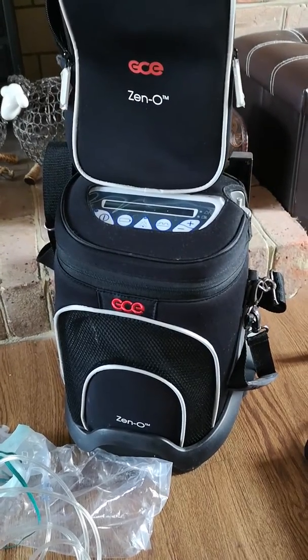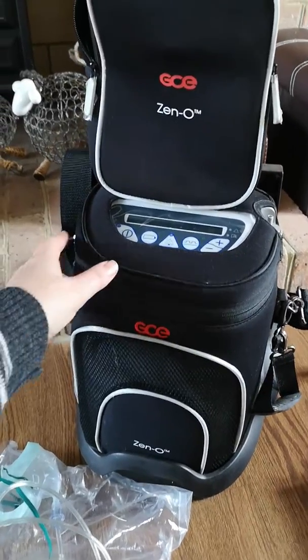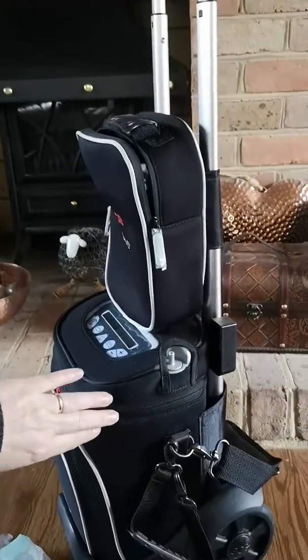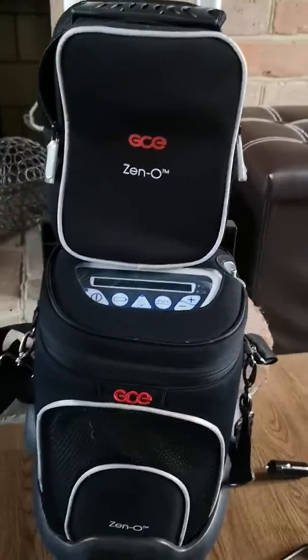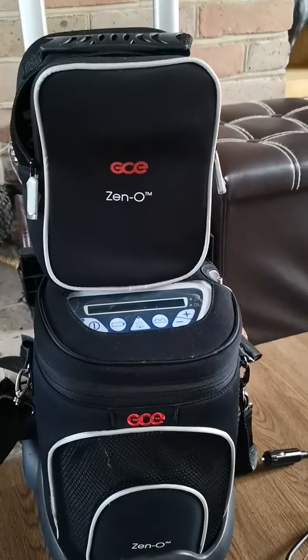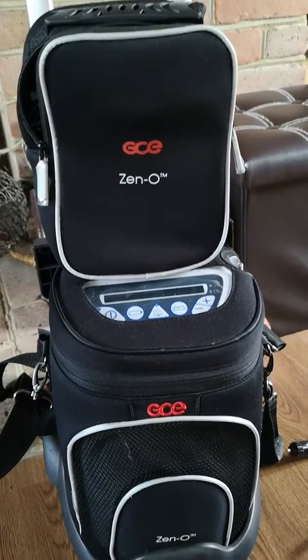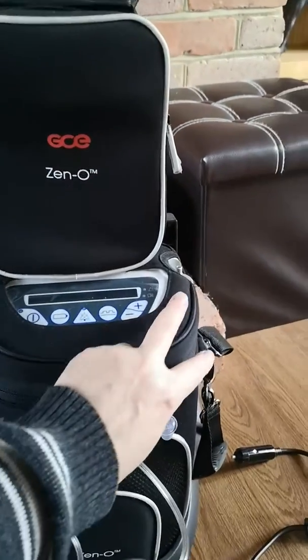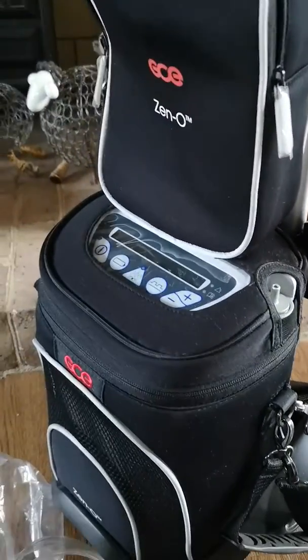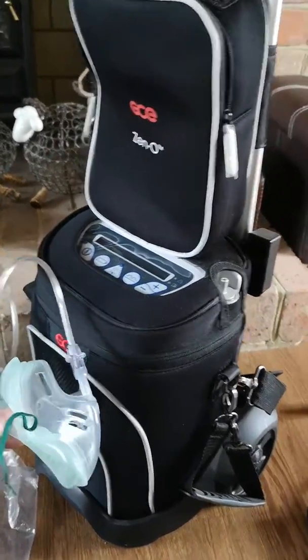Now I'm going to turn on the Zen-O Oxygen Concentrator to show you how loud it is. We don't use the Oxygen Concentrator all the time — we use it when his asthma is super bad and he's got a chest infection. So for us it's not so much of a problem, but for others that use this all the time, every day, you need to know what the noise is like.